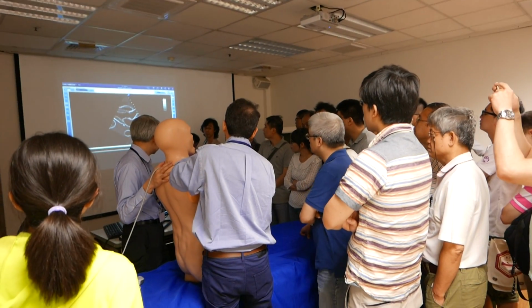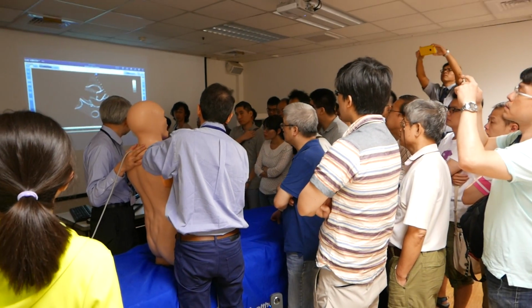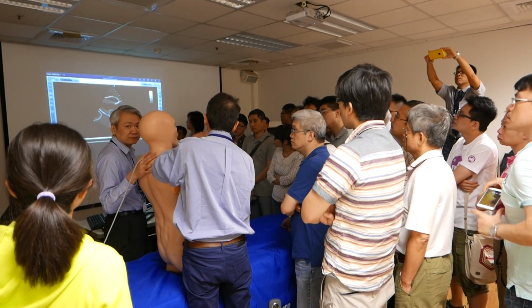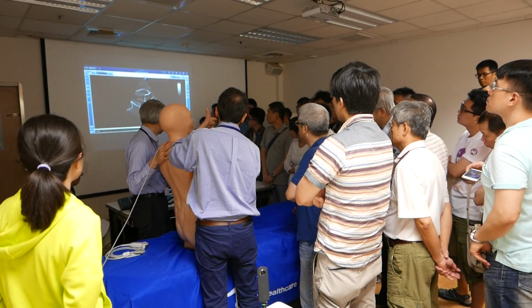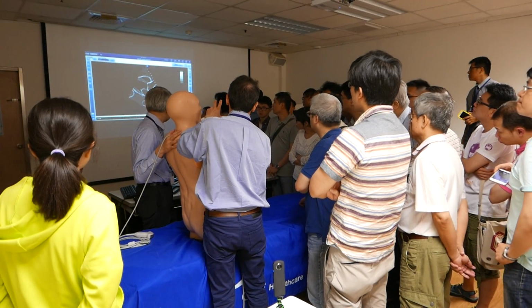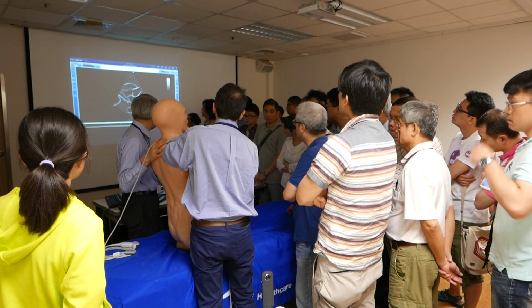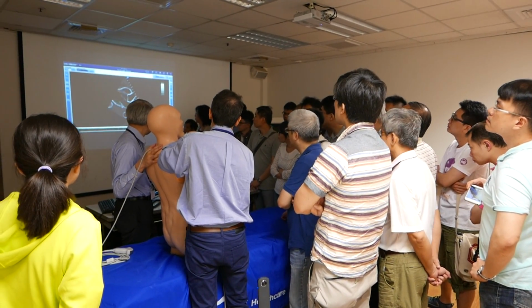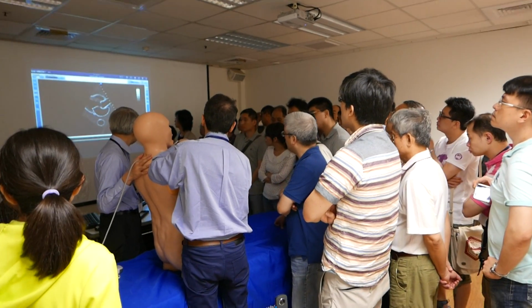So, as I was telling you, the parasternal view, in order to be correct, needs to achieve three goals. We need to see first the aortic valve, we need to see the mitral valve, and we need to maximize the size of the left ventricle. It is quite easy, if you tilt the probe a little bit, you see, to have a small left ventricular cavity. You really have to aim for the largest possible left ventricular cavity.